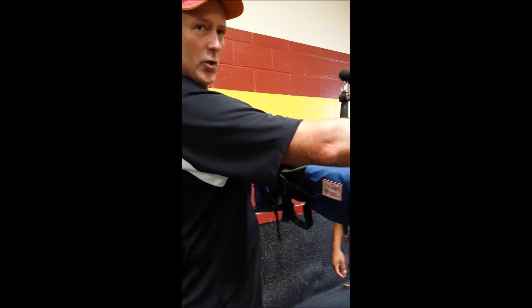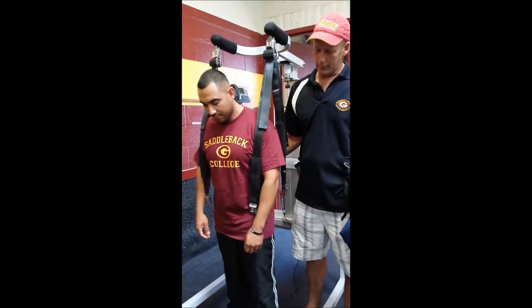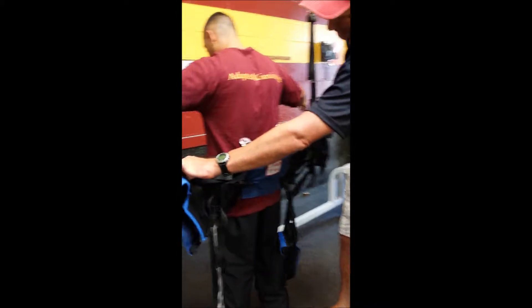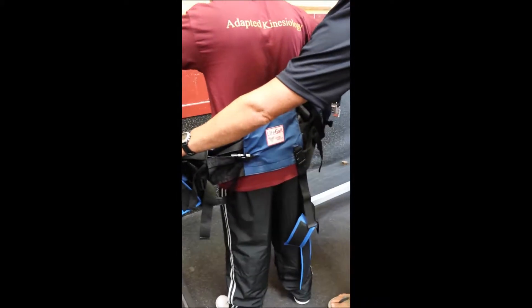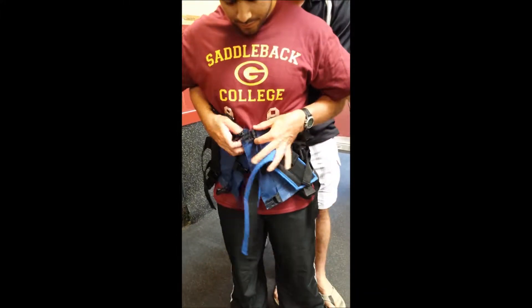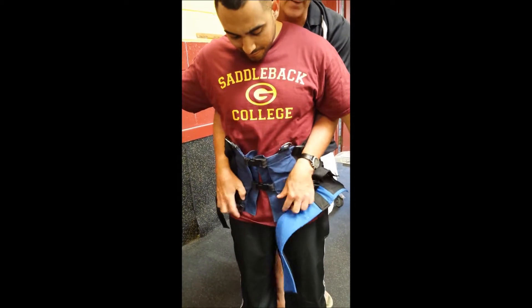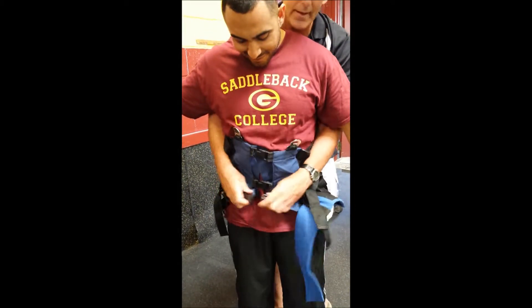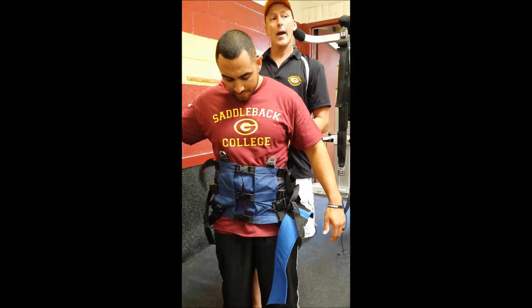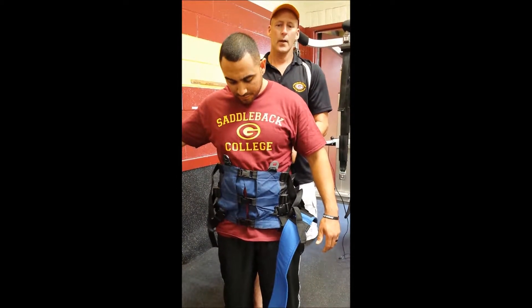Tim, let's have you scoot forward for video's sake. The Lightgate harness goes right around his lumbar-sacrum area, then we'll have him pivot and come around front. It's too loose — Tim is skinnier than the last person that was on it. There are three attachments here on this side. I've actually been able to teach some folks who've had strokes how to put this on with one hand.